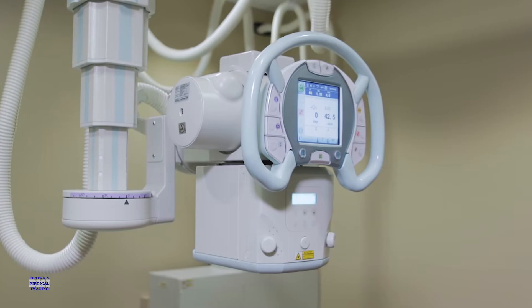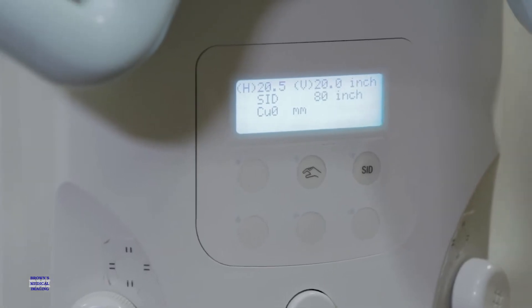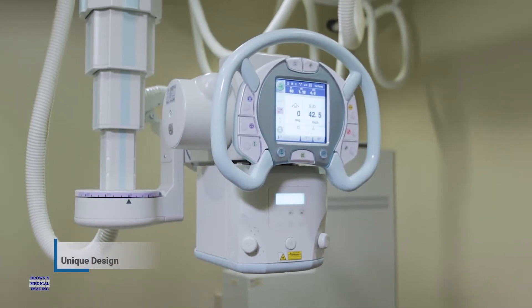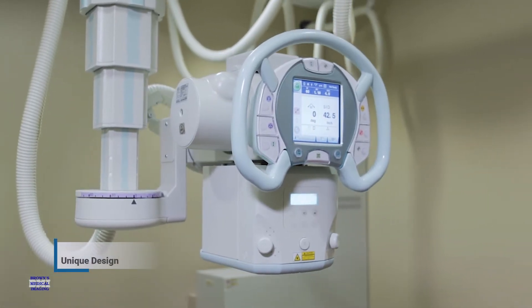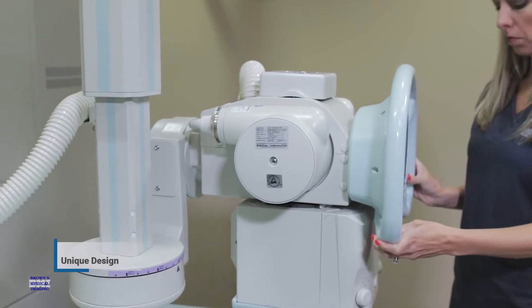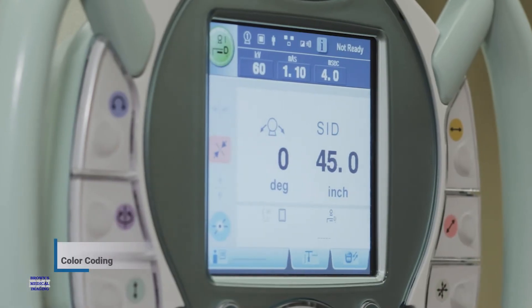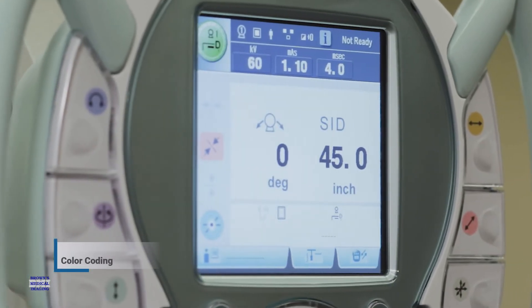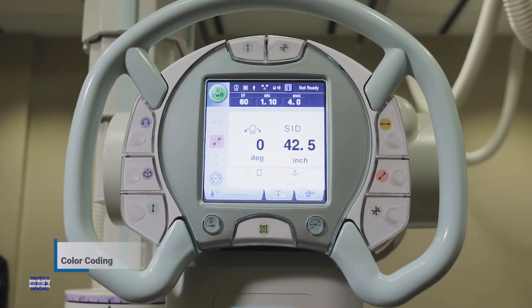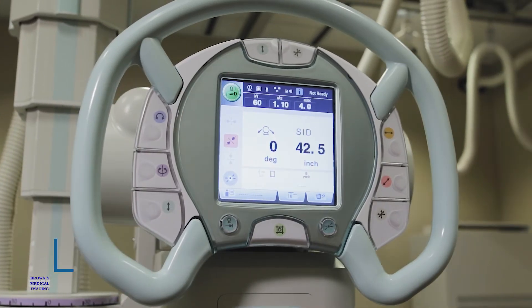Shimatsu, being a radiography-centered company, goes to great lengths to design its equipment with the technologist in mind. The first thing you will notice about the RadSpeed is its unique ergonomic steering wheel shape. Shimatsu does a great job of placing buttons in a comfortable location for the technologist while maximizing workflow. Another helpful feature Shimatsu utilizes is its color-coding sequence, which allows the technologist to see the color associated with the button or movement needed to position the equipment easily and comfortably.